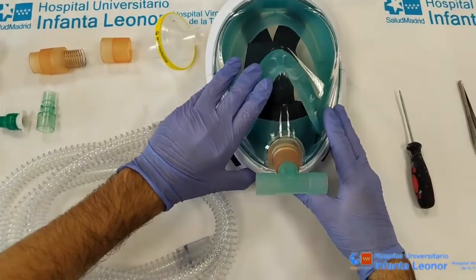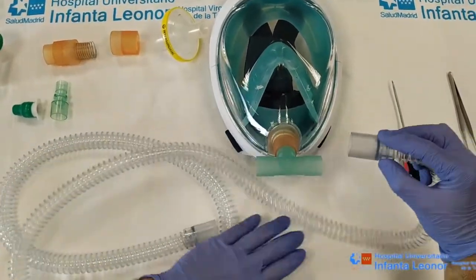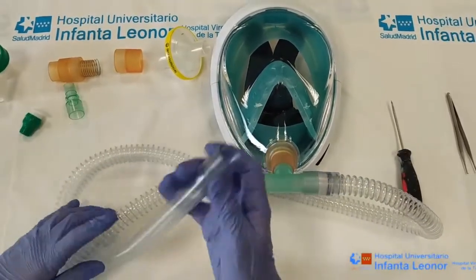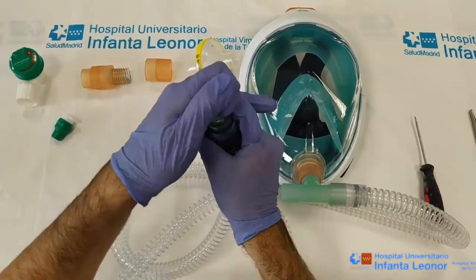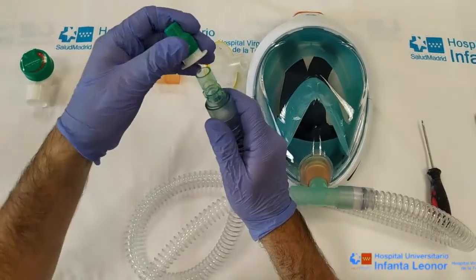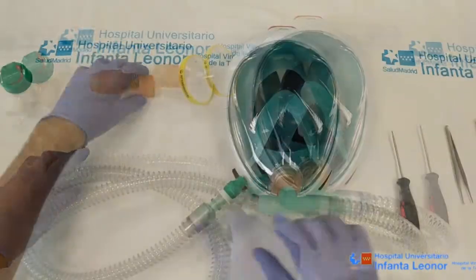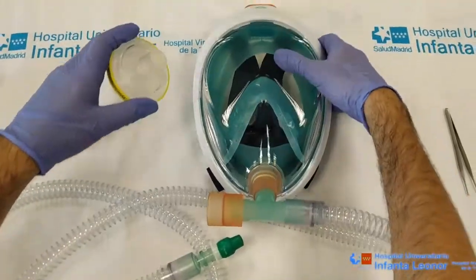Next, we position a joint to connect a high flow tube which is joined via an elastomeric connection to an unflow meter, allowing a high circulation of oxygen. Next, on the other branch of the T-joint, we fix the anti-asphyxiation valve.